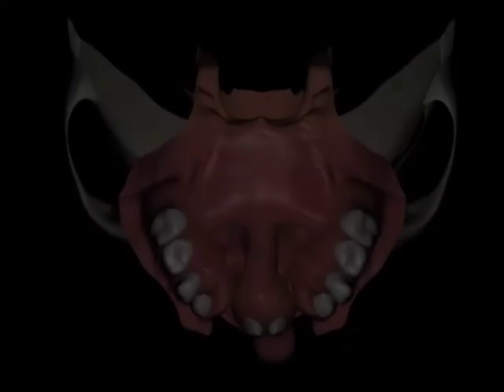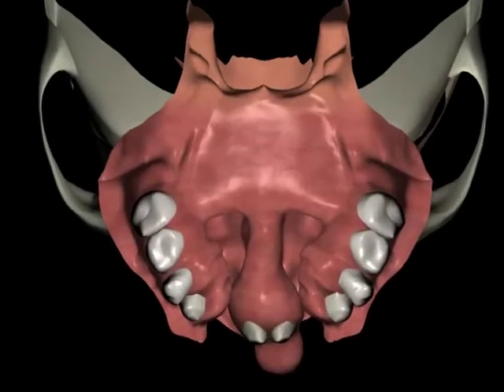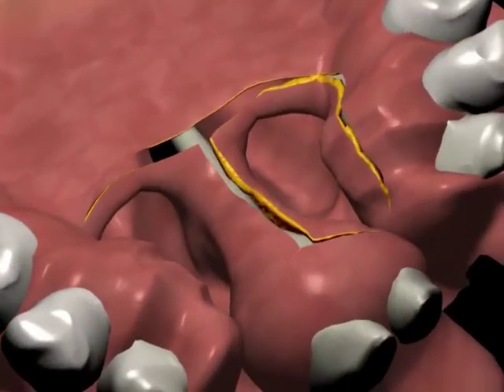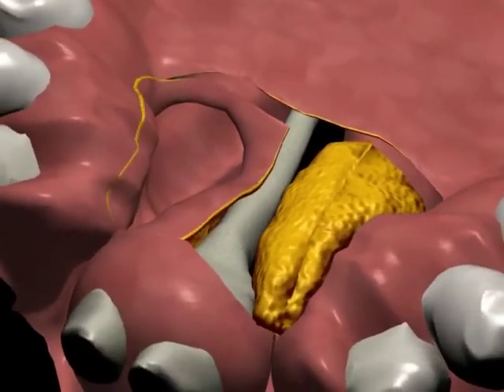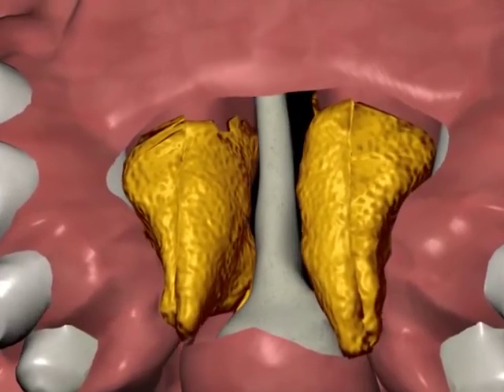With a very large fistula, particularly the anterior ones, there is not enough local tissue present to allow the nasal side and the oral side to be closed just with local tissue. In this case, the preference is given for closing the nasal side of the fistula. The oral side is separated from the nasal side. Nasal turnover flaps are developed as they were in the previous video, and the oral side is closed.